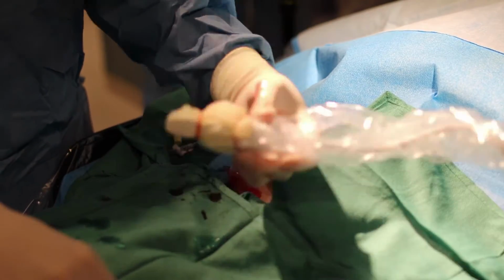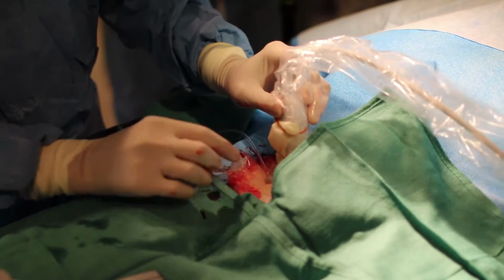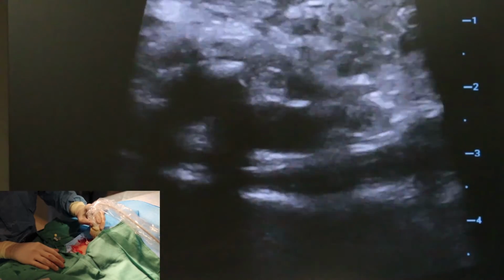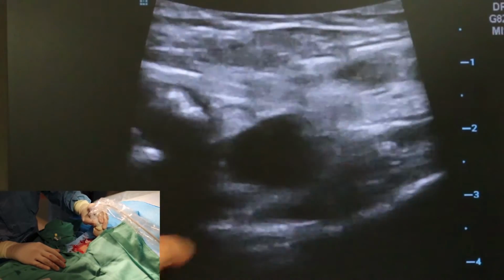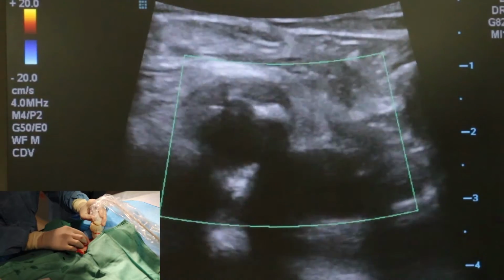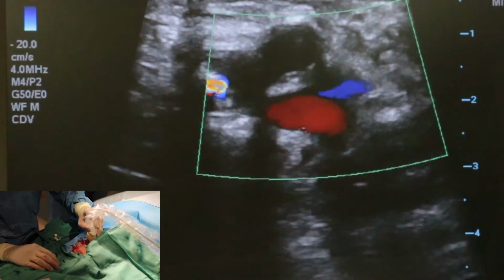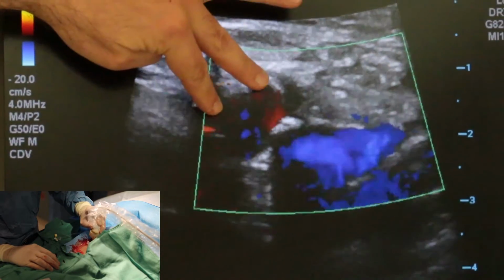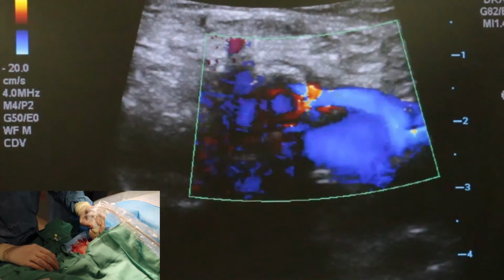I'm going to do exactly the same thing. Sometimes when the arterial sheath is in, it's a little bit harder to see the vein, but in this case you can see it perfectly. I'm going to come up, and you'll see I can compress it. I'll show you. There's the bifurcation, actually, the two vessels. I can go up a little bit more. So that's the common femoral, and to the right of it is the femoral vein.